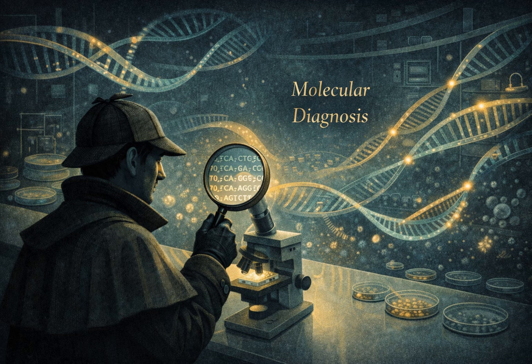The absolute classic example of this is Clostridioides difficile. A PCR test for C. diff looks for the gene that codes for the toxin, like tcdB. It detects the potential for the bug to cause disease. It does not prove the bug is actually producing the toxin. Correct. So if you have a patient in the hospital who is perfectly healthy, no diarrhea, but you do a screening PCR and it's positive, that patient is simply colonized. The bug is there, but it's not doing anything. The positive result is, in that context, clinically irrelevant.